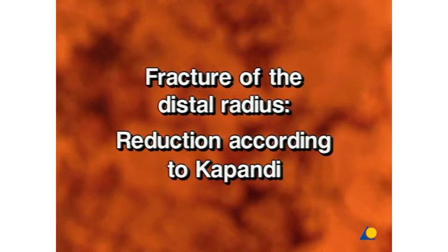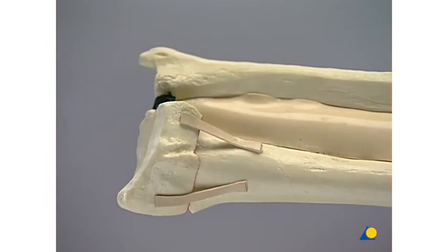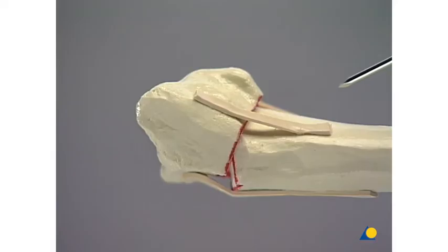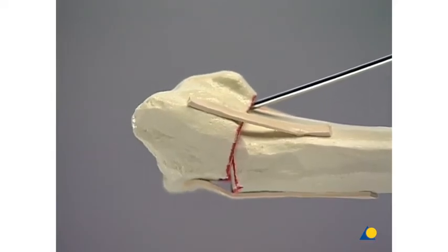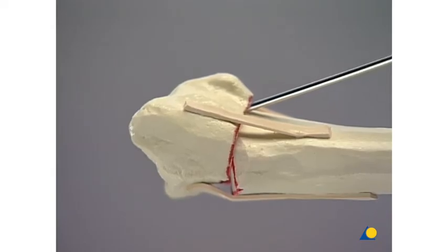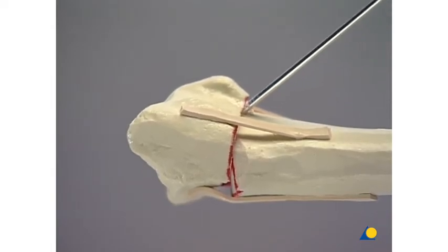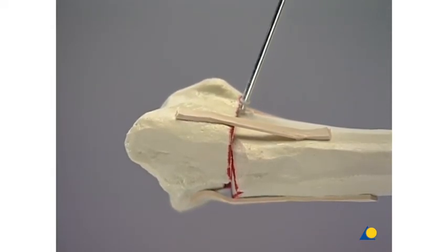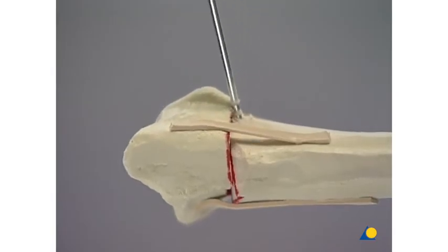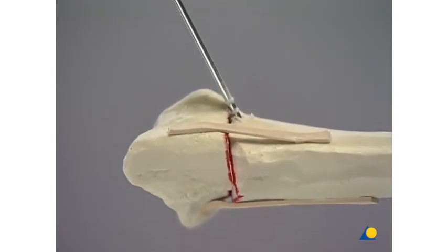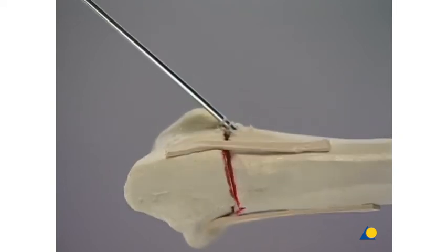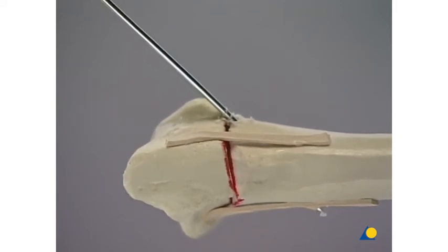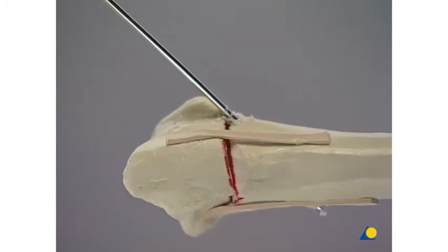Fracture of the distal radius. Reduction according to Kapandji. A K-wire is inserted under image intensifier control into the fracture site on the dorsal side of the radius. The fracture is reduced by simultaneously drilling and tilting the wire in the distal direction. The final fixation is achieved by perforating the far cortex with the same wire.